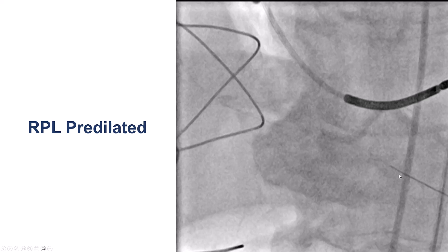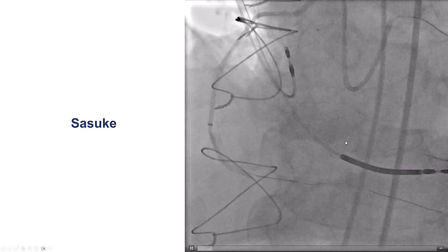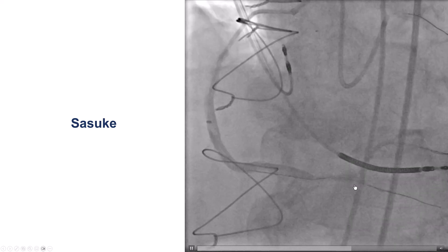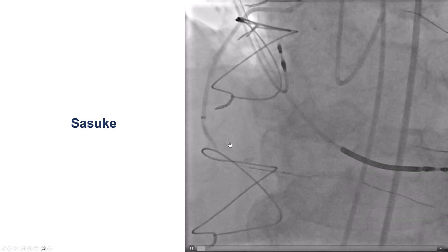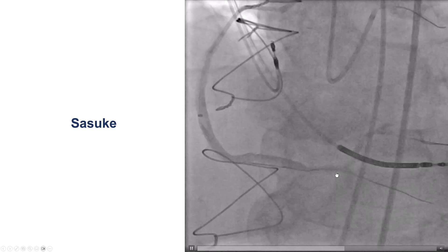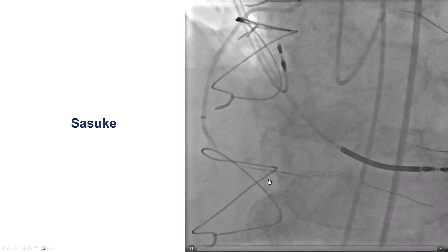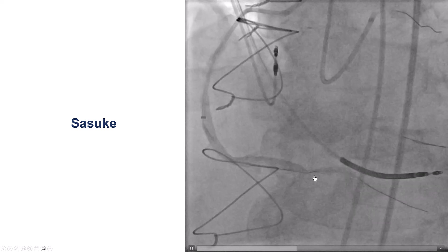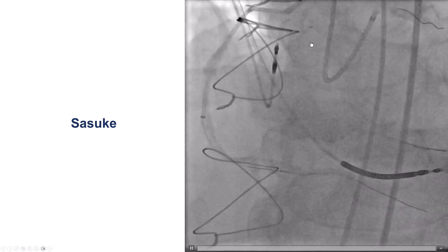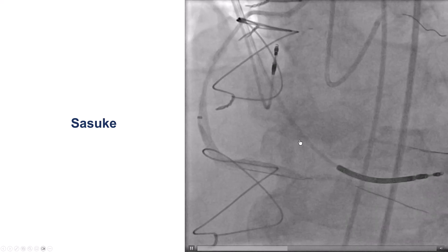We had now gained wire access into both the PDA and the posterolateral. But it is ideal to not stent in the vein graft but instead recanalize the native coronary. The injection through the saphenous vein graft confirmed flow into the PDA and the posterolateral. Our next step was to try to go retrograde from the distal right coronary artery through the saphenous vein graft to the proximal right coronary artery.